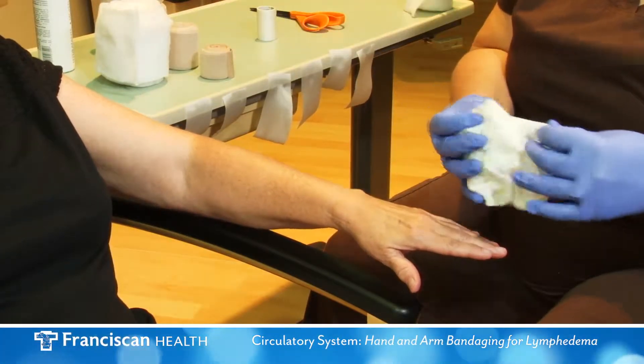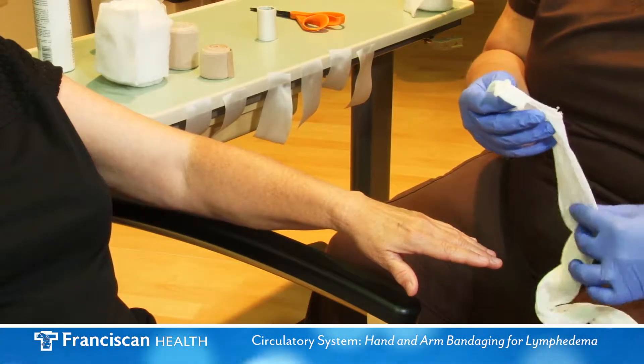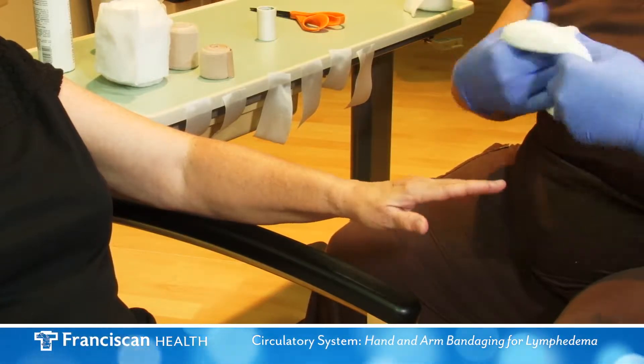The tubular bandage or stockinette should have a hole cut to allow for the thumb. Smooth the stockinette out over the hand and the entire arm.